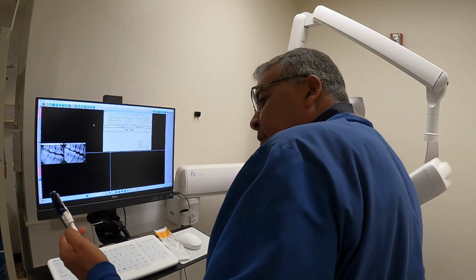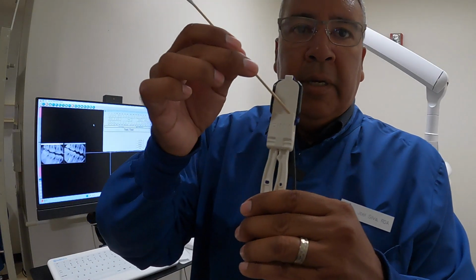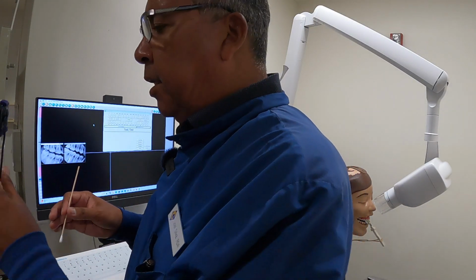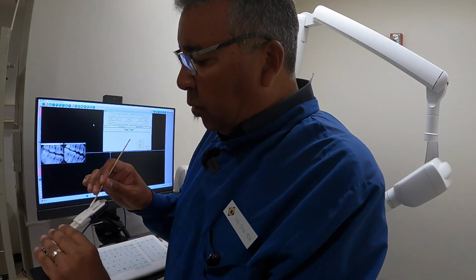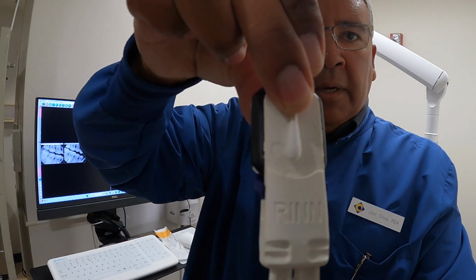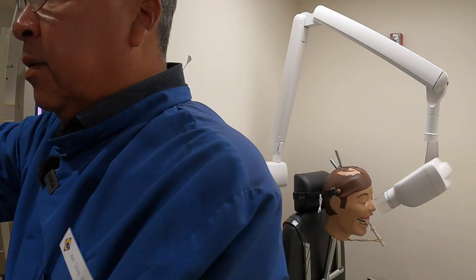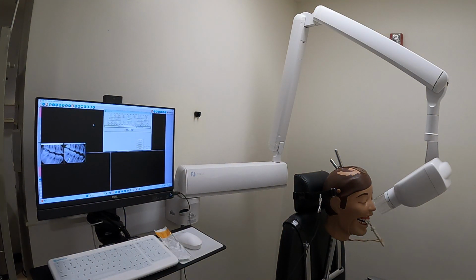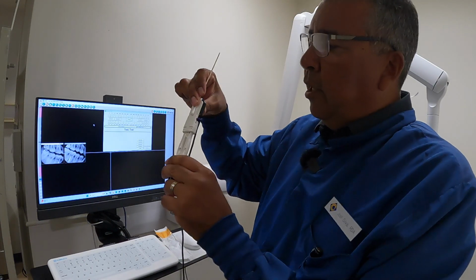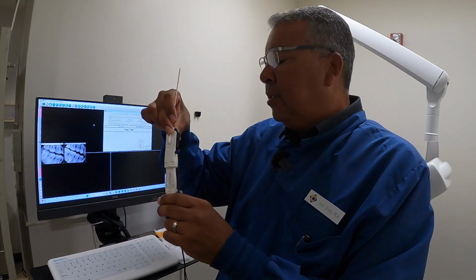And I also want you to notice this. There are very subtle differences. You've got a little curvature right here. Whenever you take your patient's anteriors, those incisal edges are a reference point for you. If that cotton tip applicator was your anterior tooth, your incisal edges would come about that far from that little circular half moon thing. If it goes a little bit further, you're going to cut off your incisal edges. If it's too far back, you're going to cut something else off. What is that something else? The apex. Yeah, the apex is going to be missing.